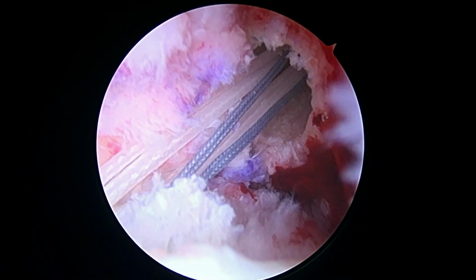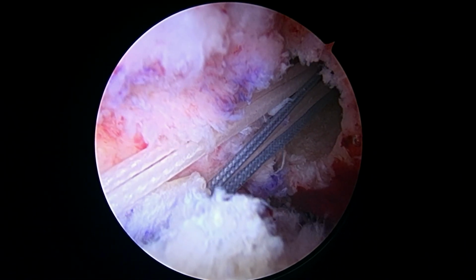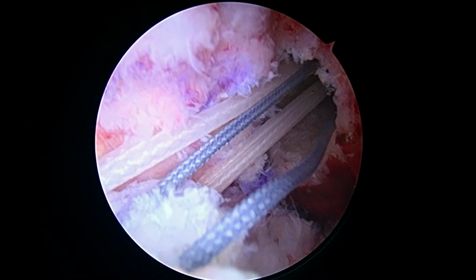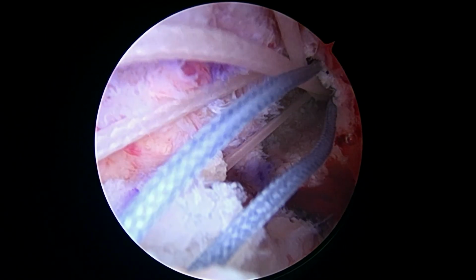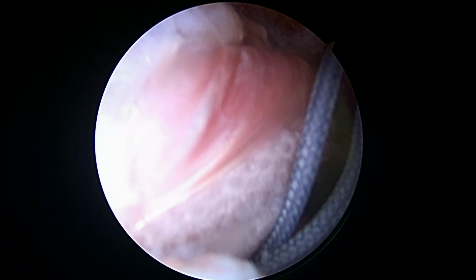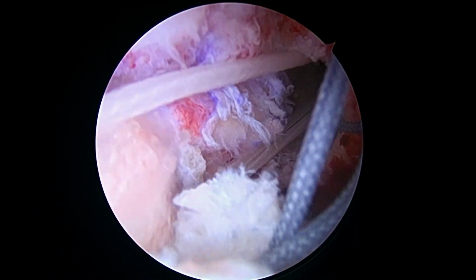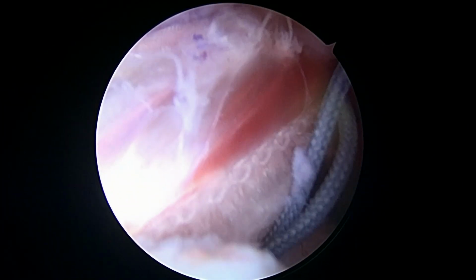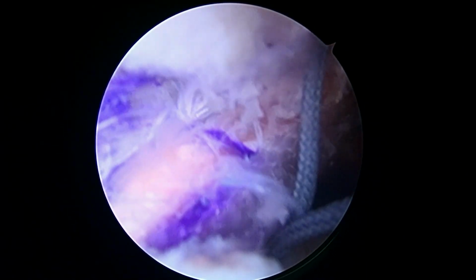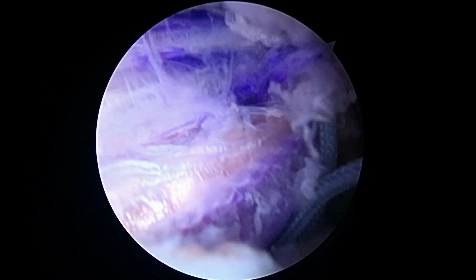Okay, so we're going to go ahead and, here, hold this, seat the graft. We're going to pull up on the adjustable loop here. And it's a really neat device. You can see how it just pulls that right into position. And it's just disappearing into the tunnel just like it's supposed to. We'll show you some more in a minute.